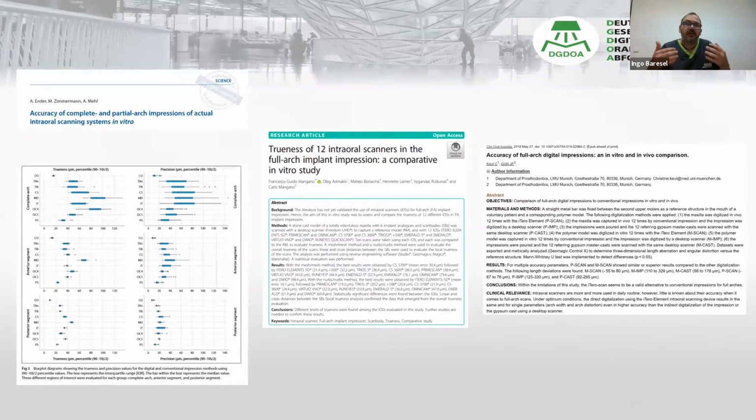We have accuracy regarding the whole arch from under 50 microns. Most of them were between 20 and 30 microns. So this is absolutely accurate.